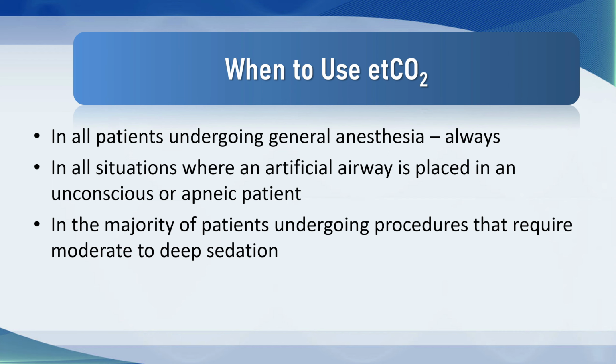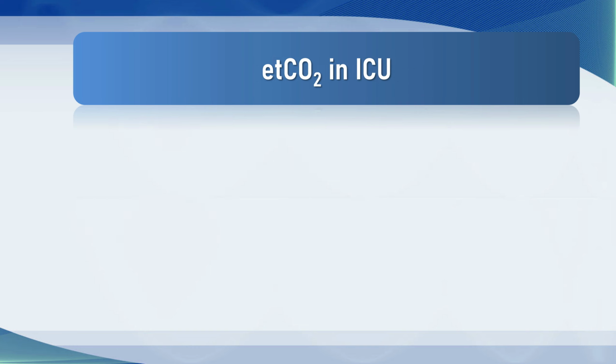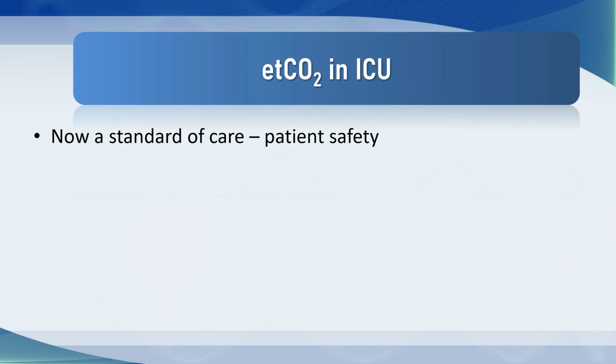And this is very much a modern standard of care, where essentially sedation is given, for example, in patients having endoscopies or sedated for surgery. What about in the ICU? Well, it is now a standard of care to monitor end-tidal CO2 in all mechanically ventilated patients in the ICU. This is based on some evidence that where CO2 wasn't monitored, there were more airway disasters.